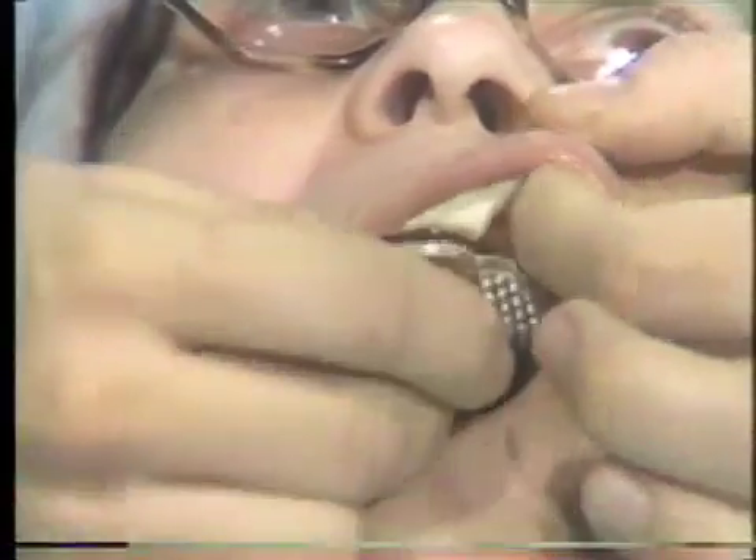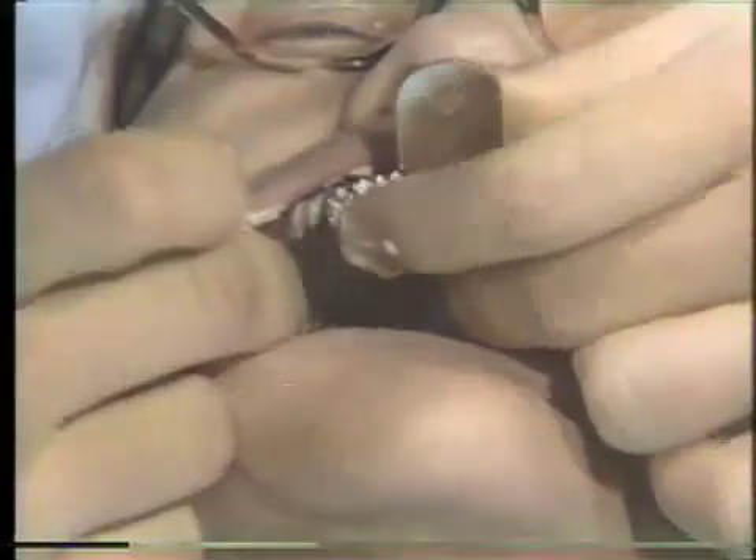Then insert the tray into the mouth and ask the patient to relax the lip. Seat from anterior to the left side, then the right side.